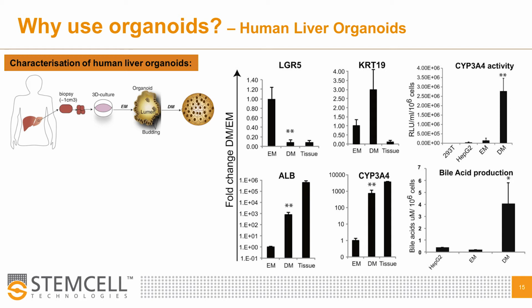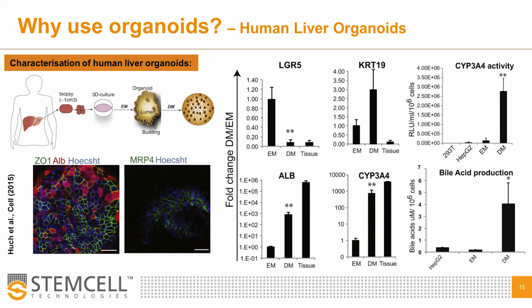In both cases, the organoids cultured in the differentiation medium represented a significant advantage as an in vitro model system over the HepG2 cells. Differentiated organoids also showed protein synthesis of the mature liver markers we have previously discussed. And when transplanted into mice, human albumin was detected in the graft, confirming the possibility to transplant and further mature organoids in vivo.